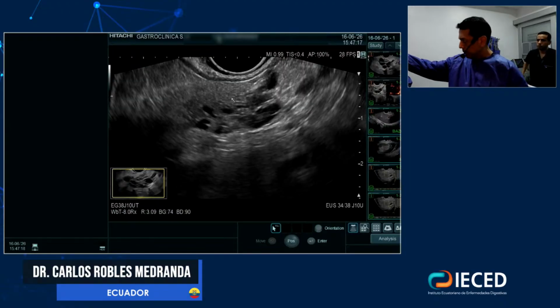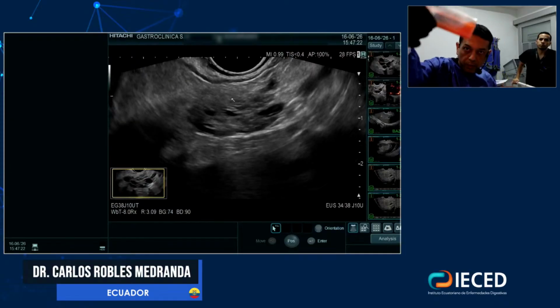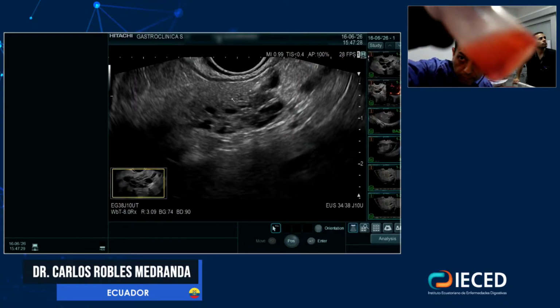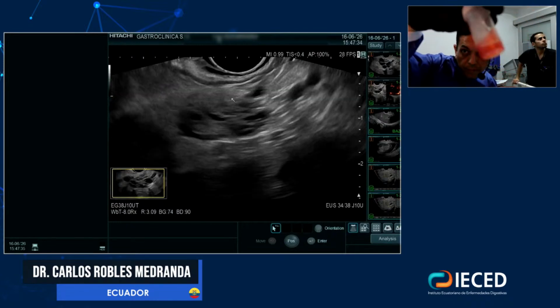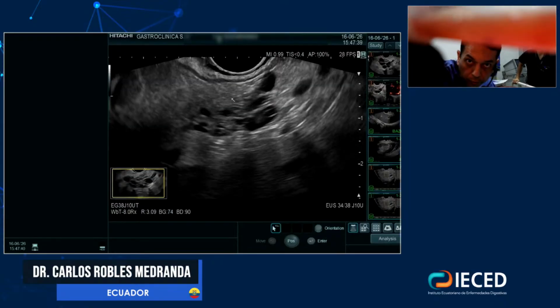Let's see. Yeah, there is very good tissue. I don't know if it can be focused better. So very good core.